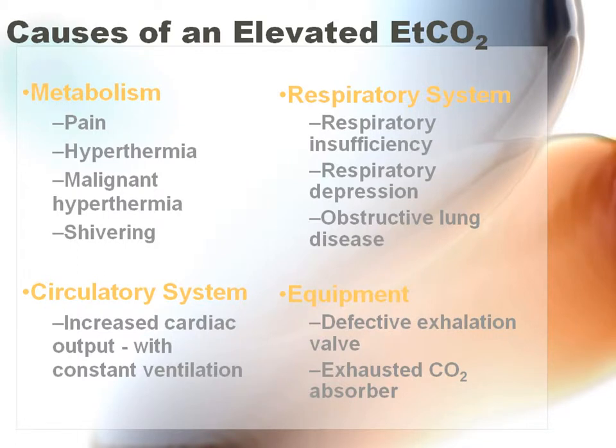Circulatory-wise, again, this is more consistent with the ventilation issues. And of course, when in doubt, look for defective equipment issues, or whatever the case may be. Maybe somebody thought it'd be funny to hook up a can of soda to what you're doing and see if we can get a reading from that.